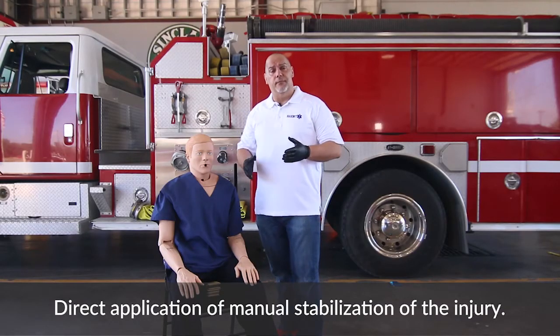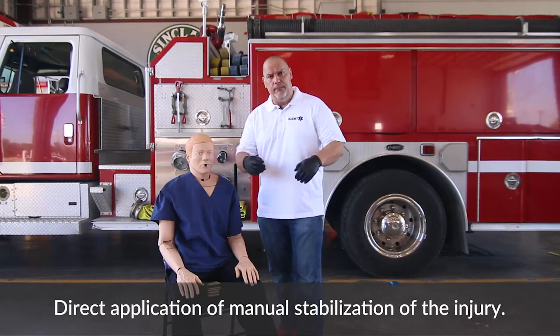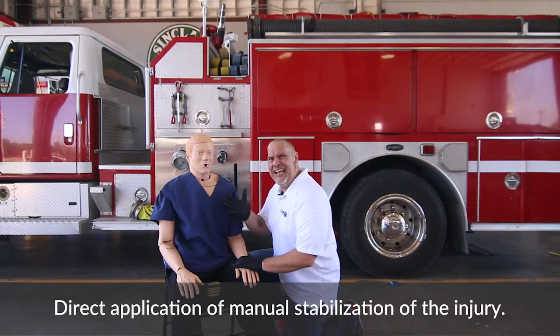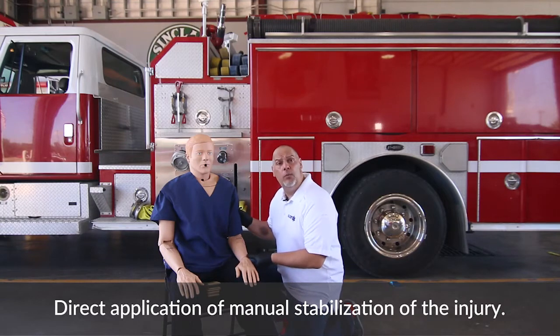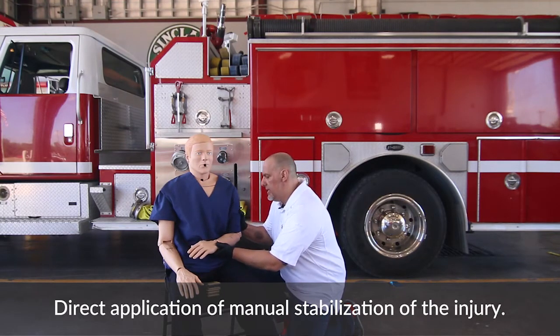What we're going to do here is simulate that the patient has a left elbow injury. So the first thing we want to do is make sure you have your PPE. We want to come up to the patient and really get down on their level — we don't want to tower over the patient any time that we can. Always be down at that level, and what we want to do is manually stabilize that joint so it doesn't move.